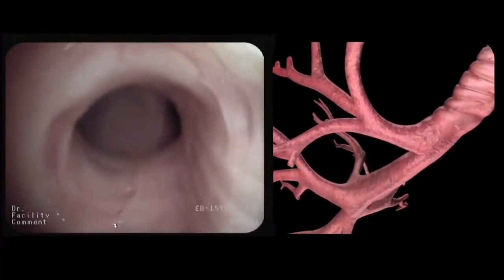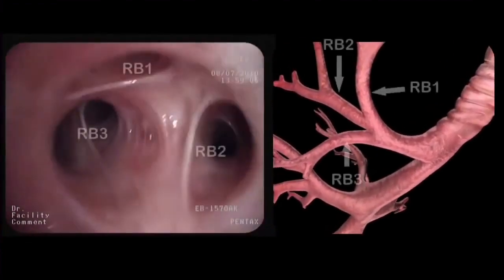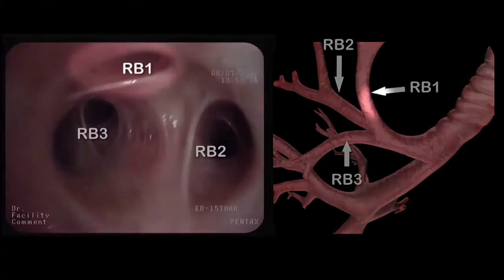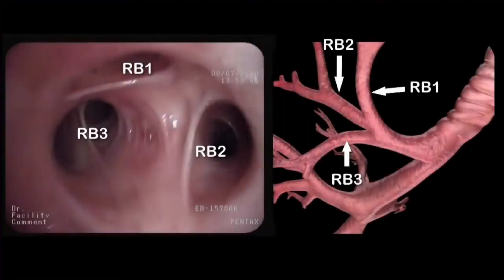We then enter the right upper lobe, which divides into the apical segmental bronchus or RB1, the posterior segmental bronchus or RB2, and the anterior segmental bronchus or RB3.